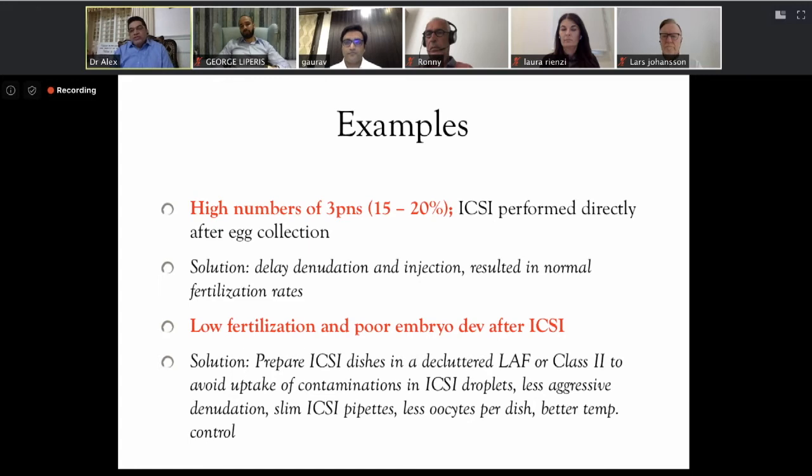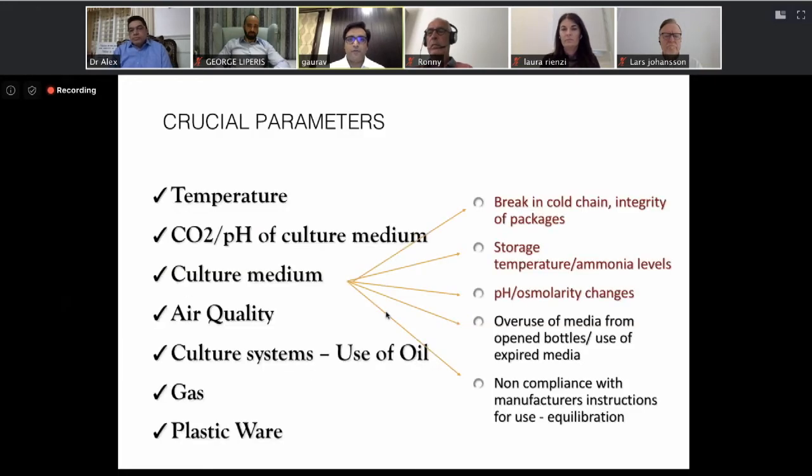So what I want to say is that sometimes the quality of the gas, not only the CO2, the nitrogen, which takes up the whole volume of the incubator, I think that is very important as part of when you are doing the validation study. Quality of gas is very, very important.